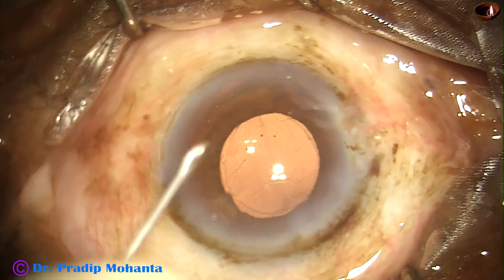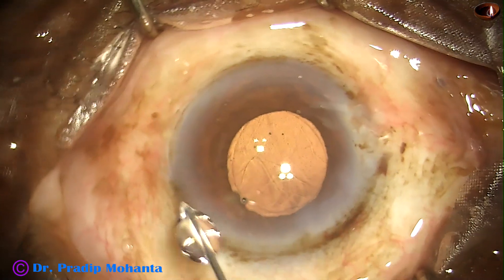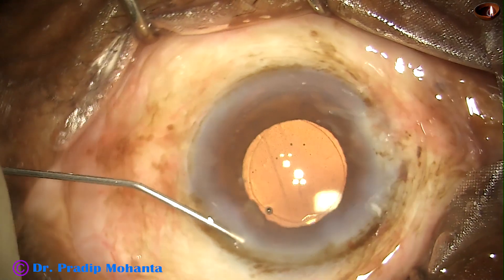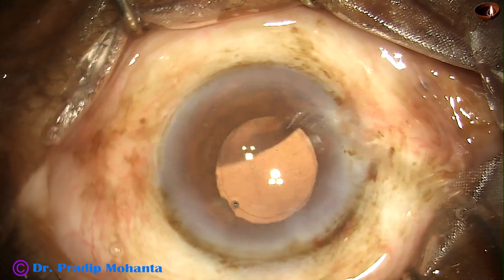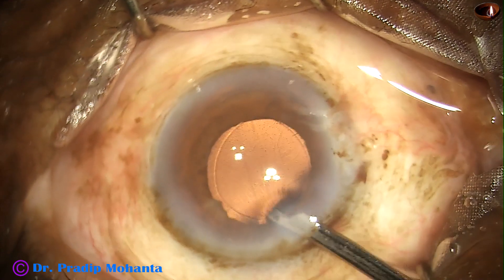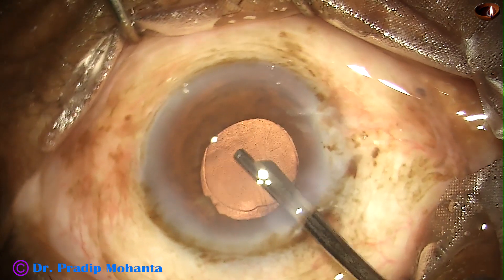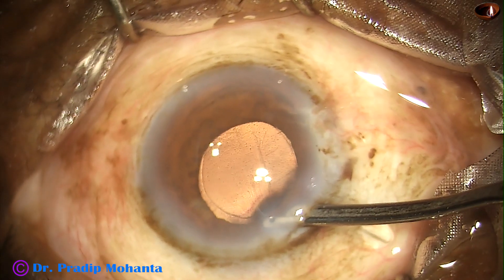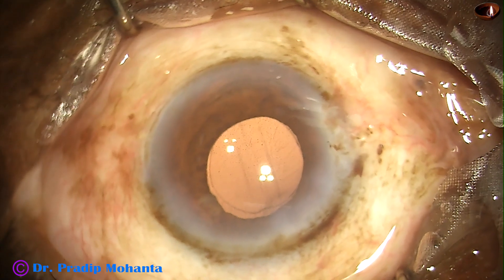This is a beautiful red glow because of stereo coaxial illumination. This is Moxifloxacin. The side port is closed by corneal stromal hydration. A final lavage of the anterior chamber is done — fluid is directed towards the corneal endothelium and whatever viscoelastic sticks to the corneal endothelium comes out. You can see the rhexis has overlapped the optic of the intraocular lens. The anterior chamber is nicely formed. All wounds are checked and the case is concluded.